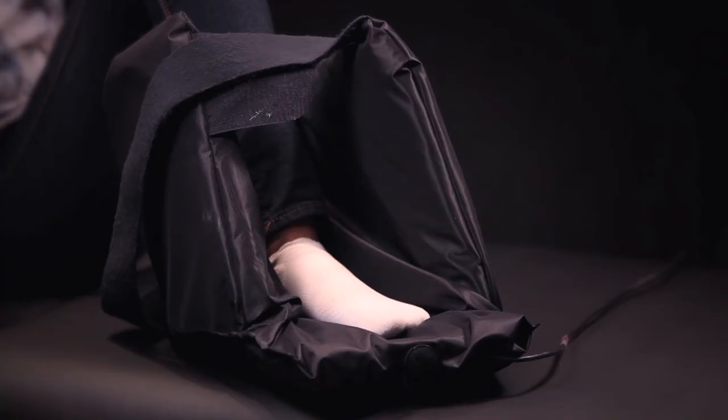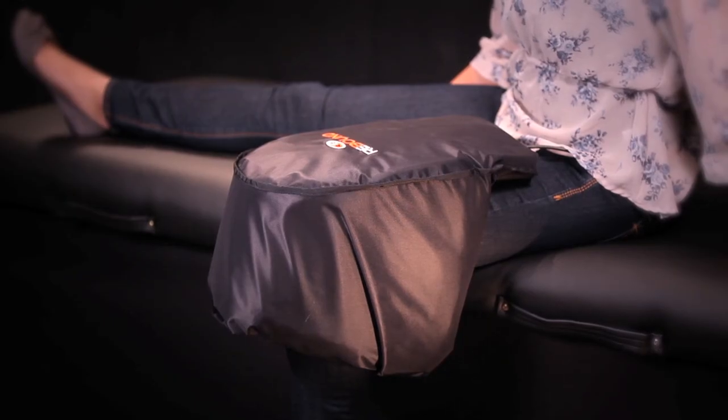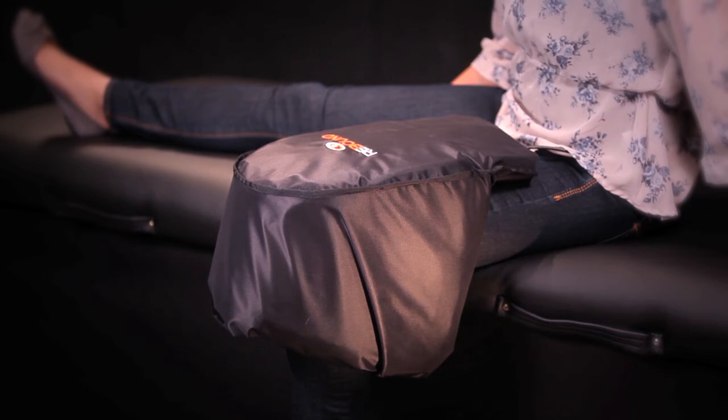Additional uses for the shoulder garment include using it like a boot to treat issues with the foot such as plantar fasciitis, or using it to treat limbs that cannot be straightened enough to fit into a cylindrical therapy garment.